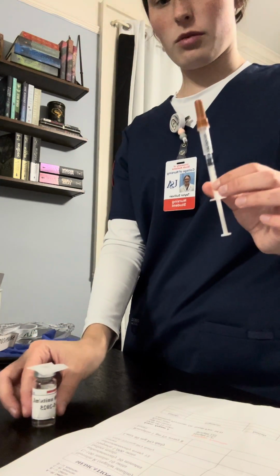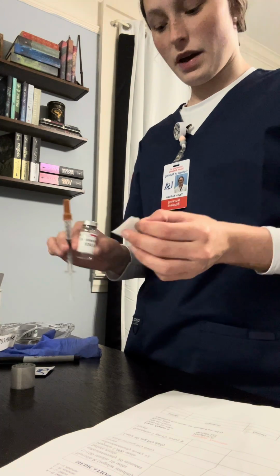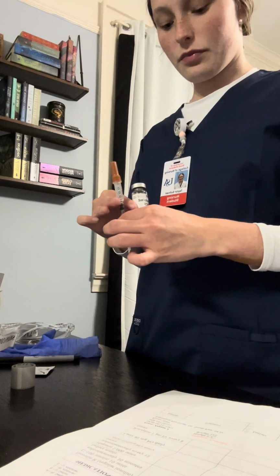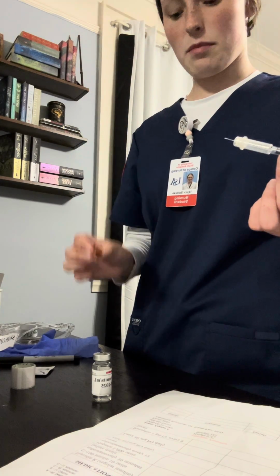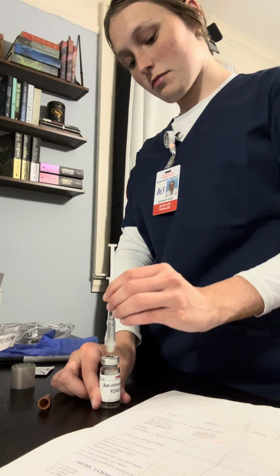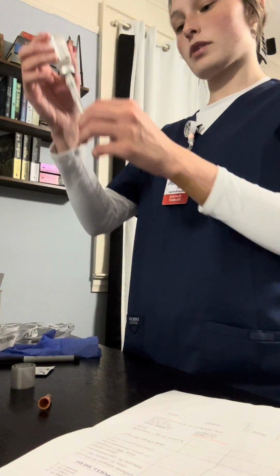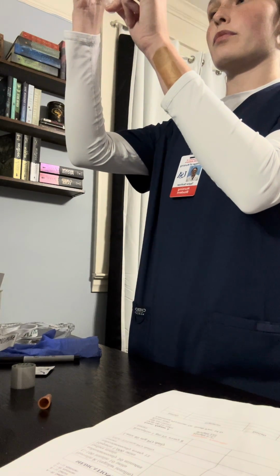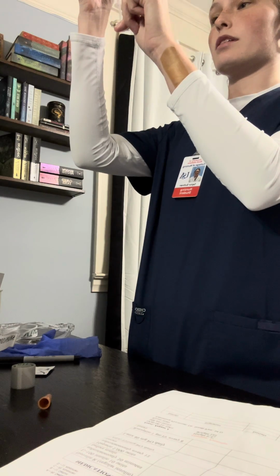Okay, so now I'm going to take off my alcohol pad, take off the cap, just set that down, and then I'm just going to pop it in and then push the air through. So my dose is 0.5.